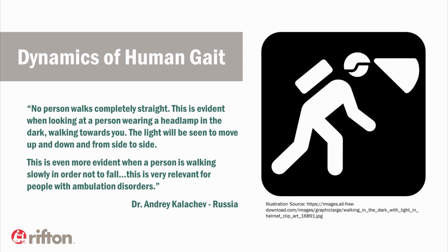So we see the relevance of this for people with ambulation disorders. We want to provide support that allows the dynamics of human gait and that the body is not having to fight against to achieve the walking.